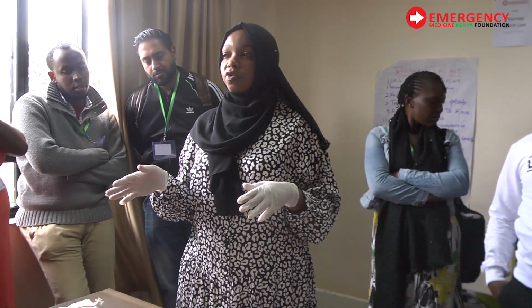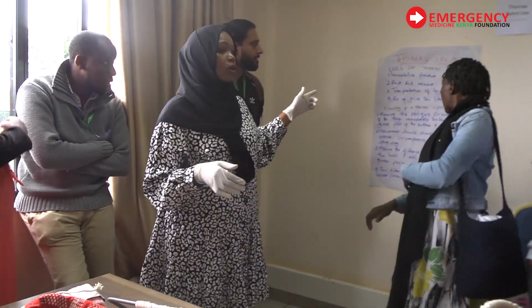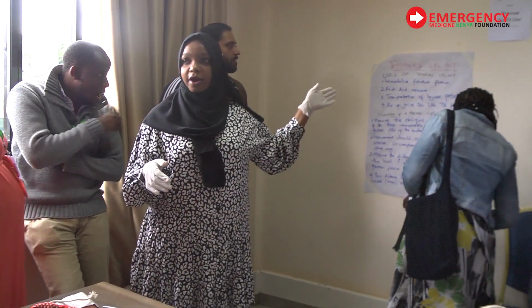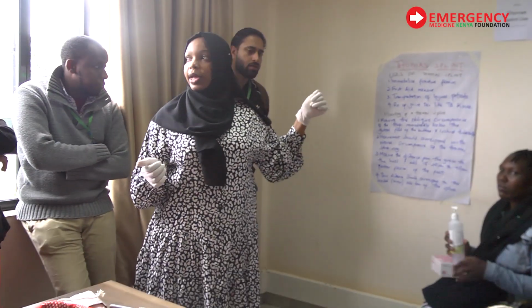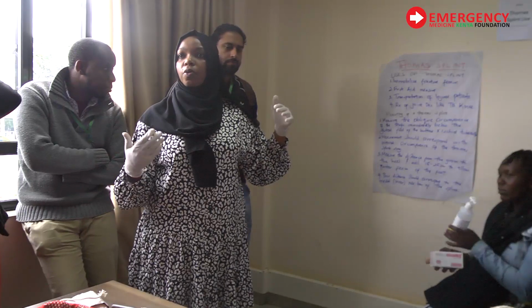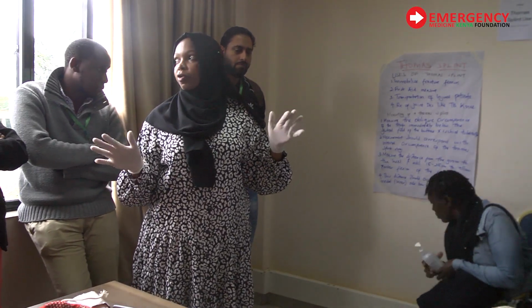So there are several indications for a Thomas splint, okay? One of the indications here, it immobilizes femur fracture, okay? Any fracture within the femur, it normally immobilizes. And the reason of immobilization normally relieves pain, okay? And that's the most important thing. You want the patient to be pain-free.